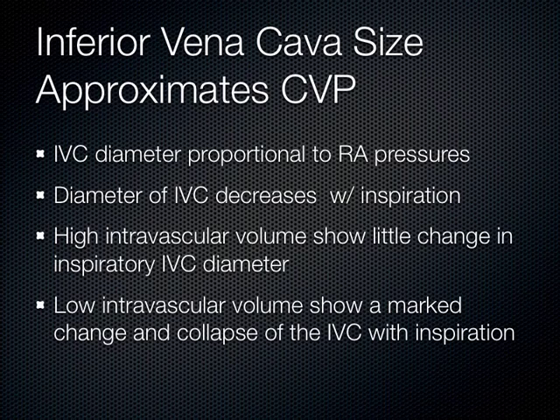It's pretty cool. But if you've got a lot of fluid, if you have congestive heart failure and you're in a fluid overload state, and when you breathe in, your IVC doesn't even budge, and it's really dilated, you need diuresis, or you need to take a medication like Lasix to get rid of some of that fluid, to pee it off, okay?